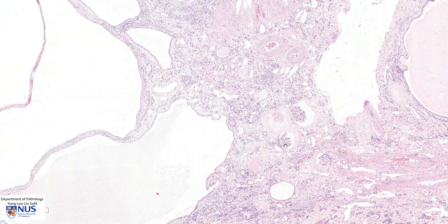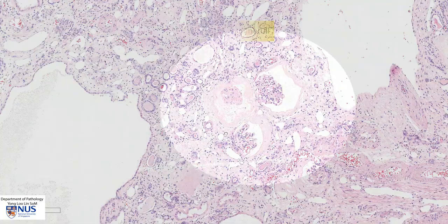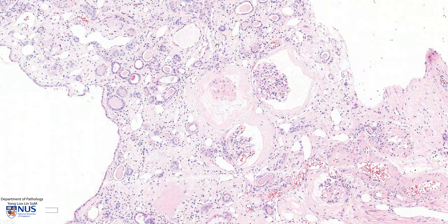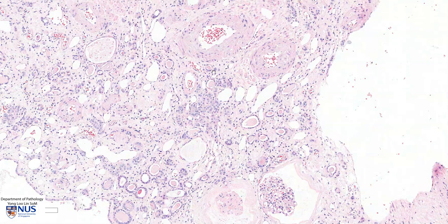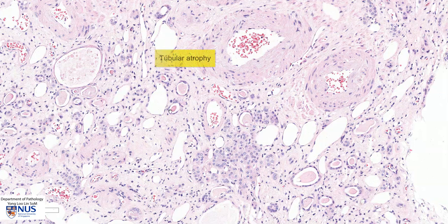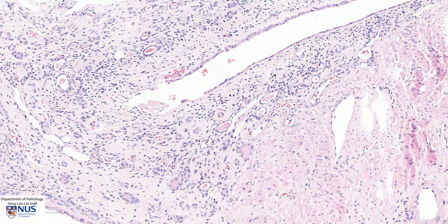In this area, we can still see a few glomeruli, and you can see that the Bowman's space is actually dilated. Here is a sclerosed glomerulus, which can be seen in this condition, especially later in life. In other areas, we can appreciate that there is significant tubular atrophy associated with interstitial fibrosis, and there is also mild chronic inflammation in the interstitium.